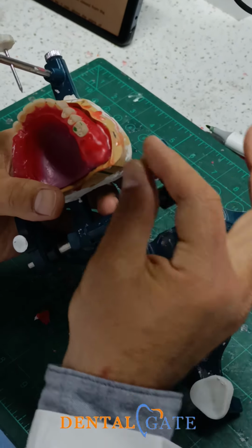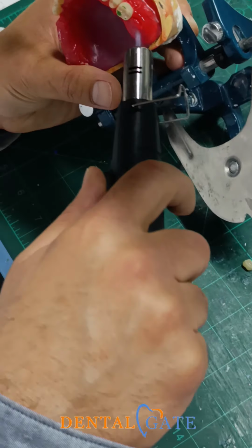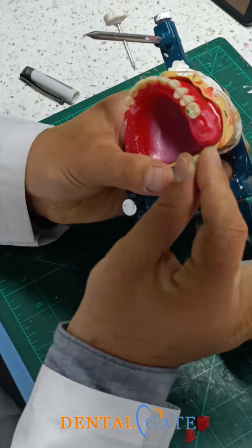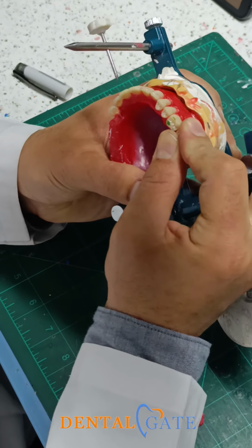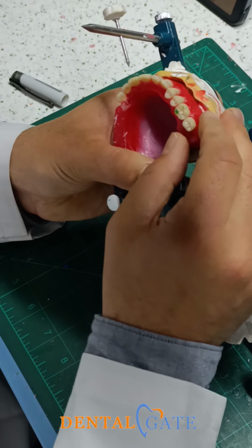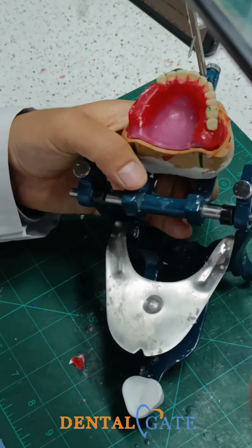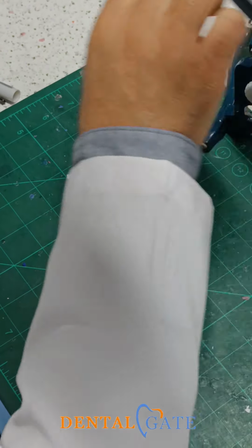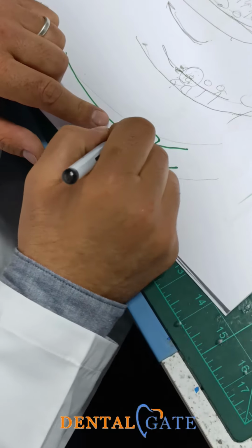There is no touching in the cusps. Same procedure. Put it with your fingers and start to make a tilting now, okay, toward the buccal, but without any contact of these cusps. Because the lower 7 is already raised. What's the benefit of no touching in the cusp? When I don't make a touching, because this curve is mandatory.